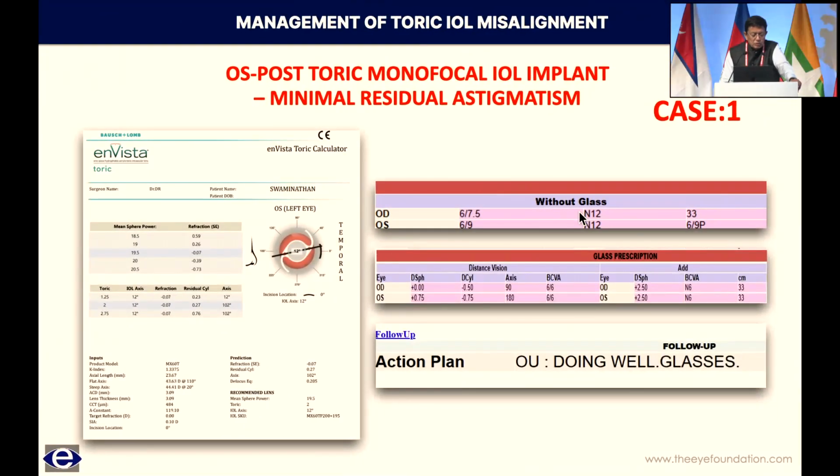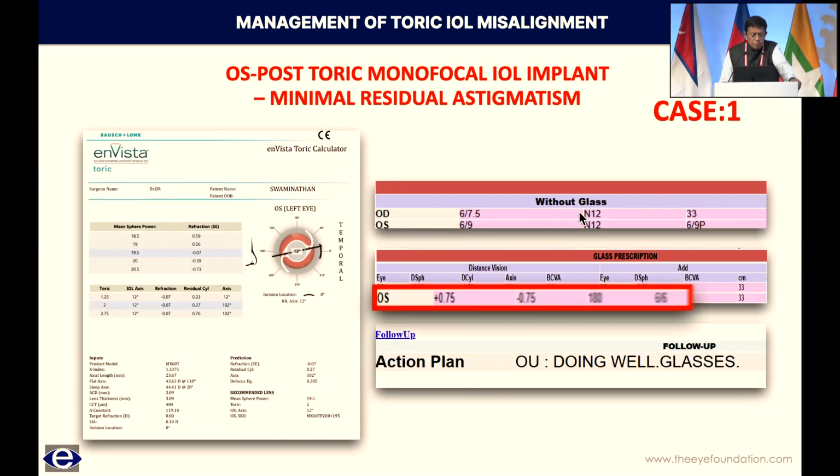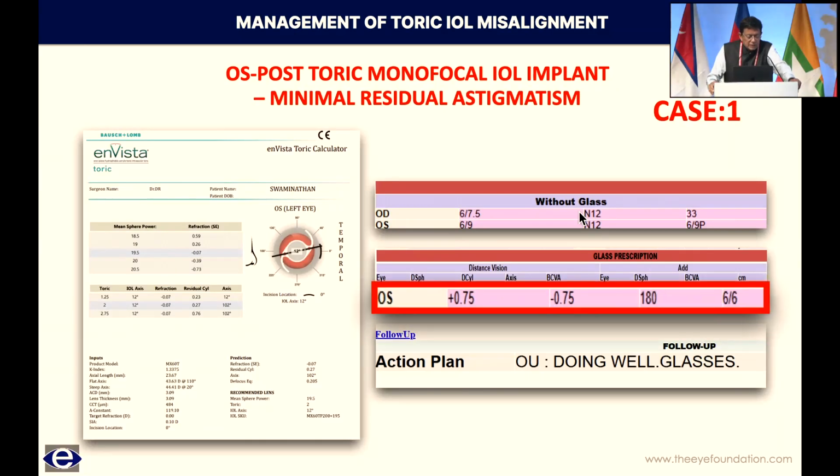As far as coming to some real life scenarios is concerned, case 1, most importantly I always emphasize, whether it's cataract surgery or refractive surgery, I ask my optometrist not to go after those small powers if the patient is happy.